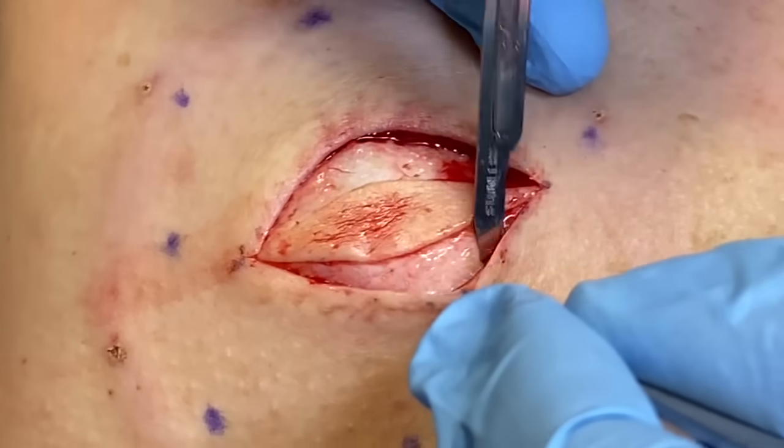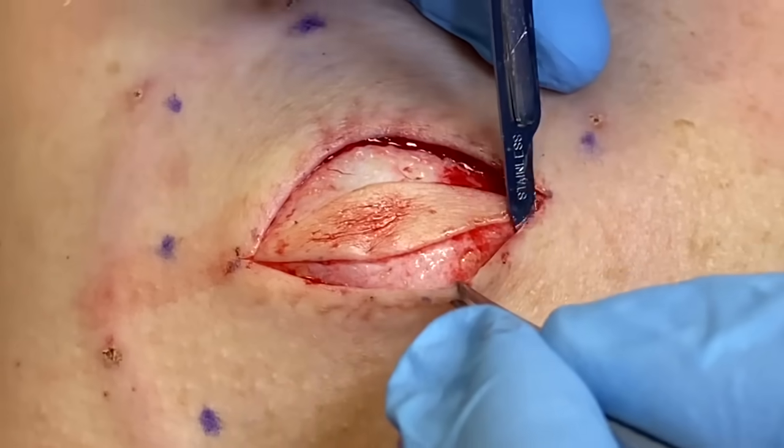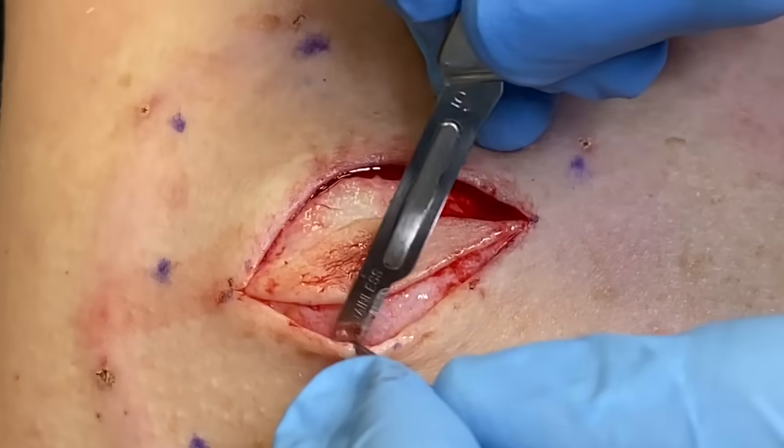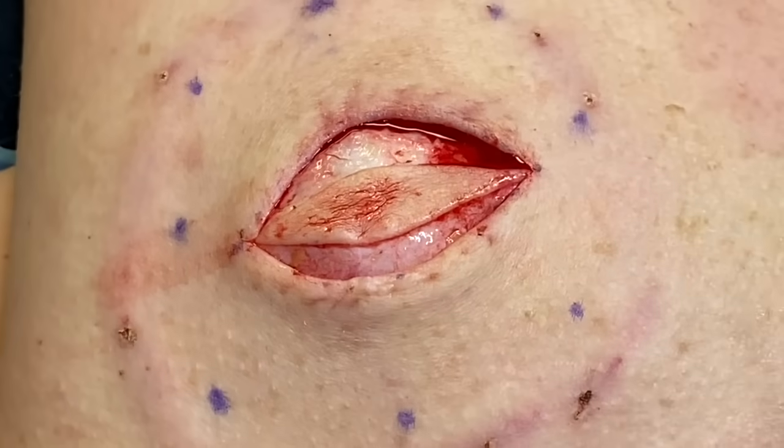So that element where I'm seeing back pressure will also dictate the angle of my blade. Because if I'm picking up that there's a lot of pressure there, then I know it's pretty superficial. I just want to be a little bit more careful in terms of how I operate.